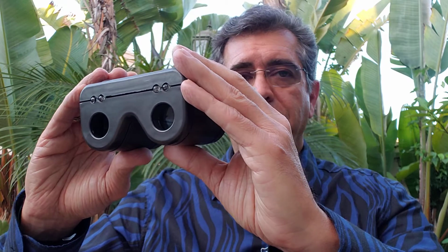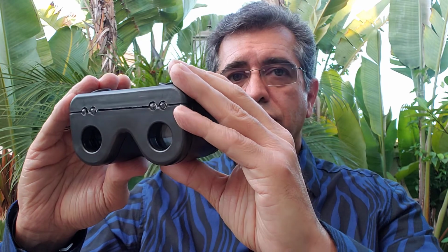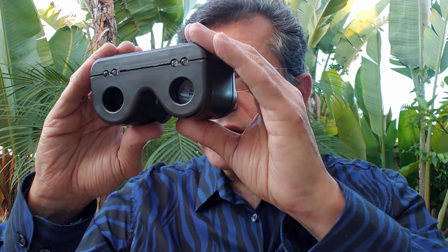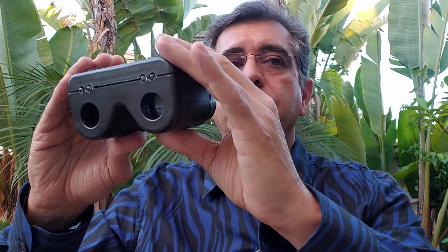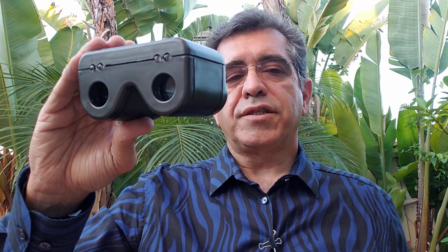To begin the test, the examination room should be dimmed to the level that you could still see the pupils of the patient. The distance of the device to the patient will be about 15 centimeters or 5 inches. Hold the instrument at that distance to the patient with both hands, and then get yourself closer to be able to look through the oculars, like this. Make sure you're in focus by adjusting your distance to the patient. If you see double, it's just fine. Just continue.